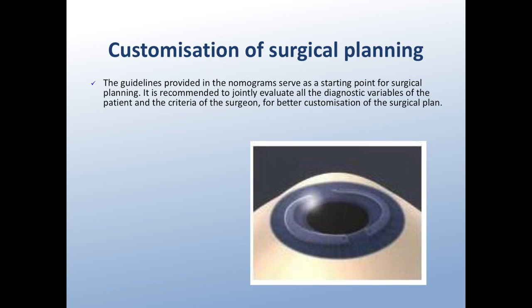I usually calculate with a calculator the point where we must go to make the vertical cut in the cornea to insert the ring. This vertical cut should be at least 20 degrees away from where the ring begins. So for example, if we have a 270 degrees bisector and our ring has 160 degrees, you add up to 270 degrees, 80 degrees on one side, and 80 from the other.